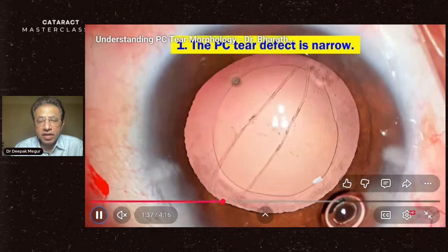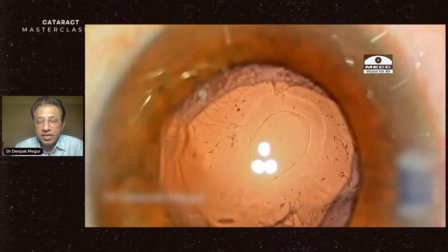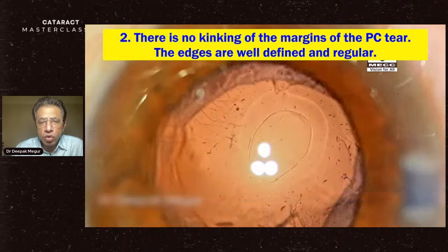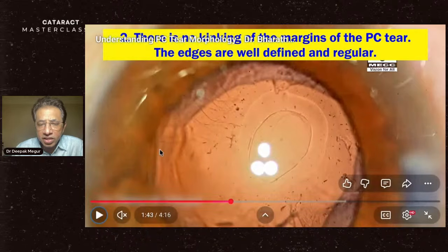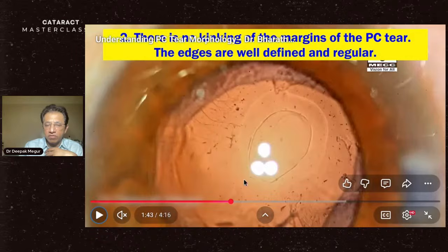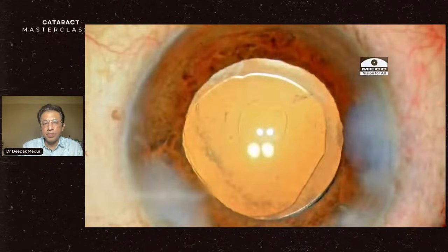These are some of the classical PC tears which you see in posterior polar cataracts. This is a round one. When you see a round or a vertical posterior capsule tear, and you don't see kinking of the margins, the edges are very well defined and regular. Kinking means distortion of the margin. This is a perfect circle. If there was vitreous, it would have dragged one edge and caused irregularity. We'll come to this. This is the second sign.